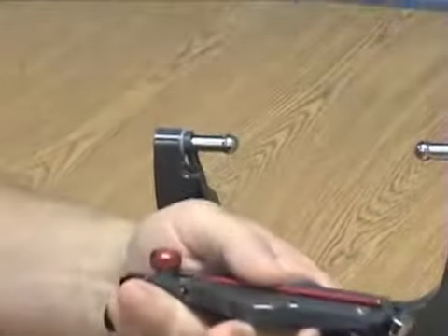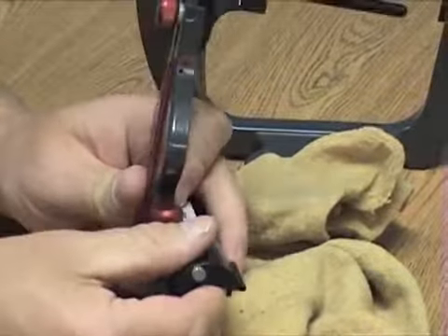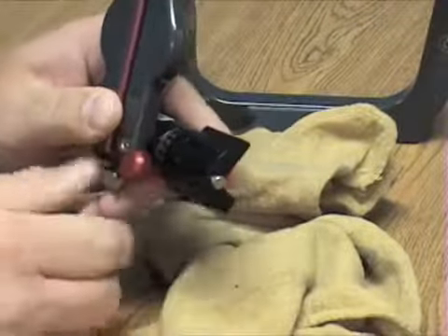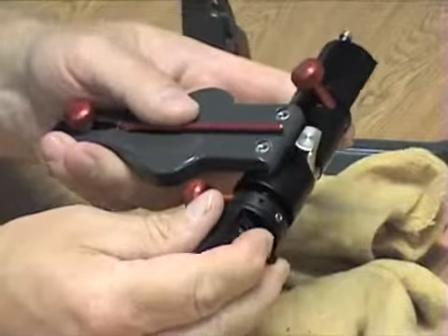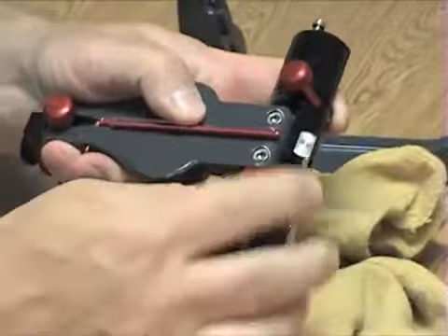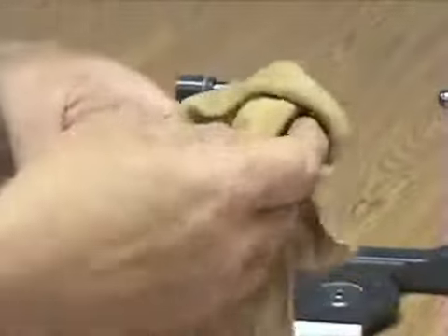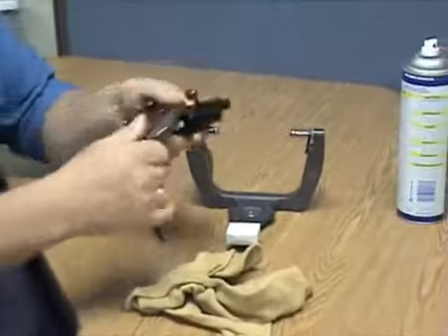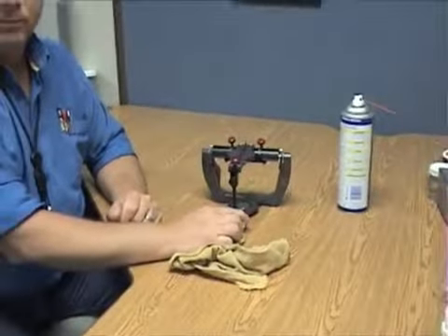Once that's done, we simply find the correct fossa for the right side, place the knob forward, put it in position, and lock it in our condylar inclination. Same thing over here: knob forward, in, up into position. Wipe things off, clean up some of that oil in the upper area, put it back on the instrument, and we're ready to go.